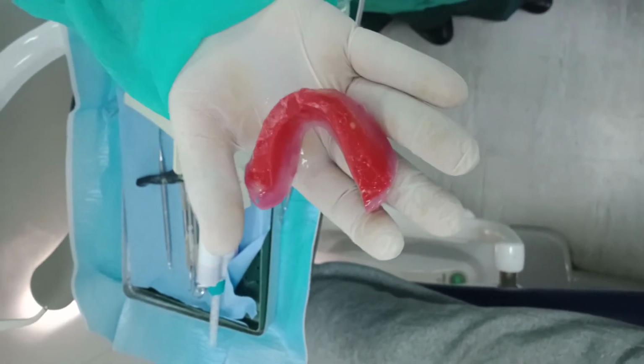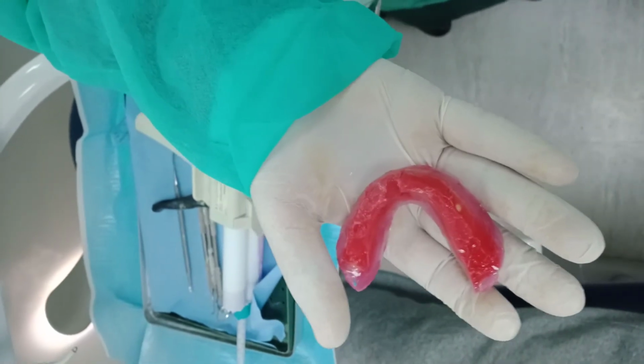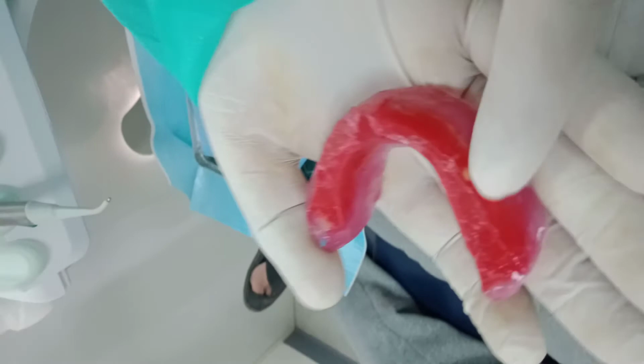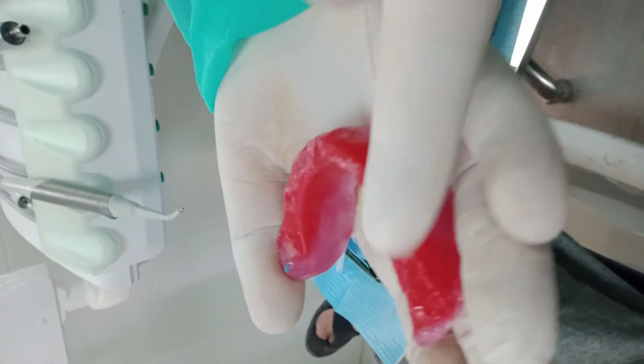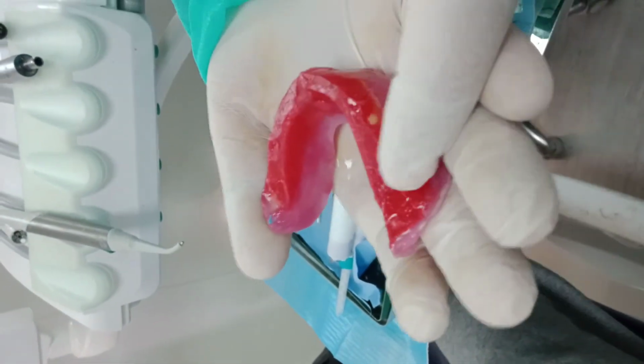So this is how we take a bite for a single denture with an interrupted occlusal table against it. Okay, so we open the window wherever we have erupted teeth. We use the posterior as our guide for freeway space and measurements, and the occlusal stops are present on the posterior, and then we're going to do occlusal with an adhesive and grooves in place.